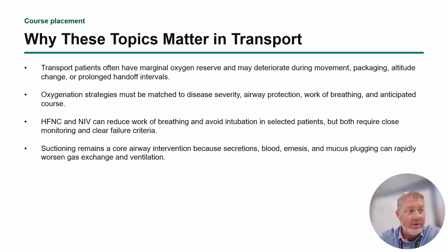Oxygenation strategies have to match the disease process that the patients have, their work of breathing, and the expected course overall that you would want the patient to have during the trip. So, high flow nasal cannula and non-invasive ventilation, those two modalities can sometimes prevent intubation, but they also fail. And then suctioning, we'll get into a little bit. That's still a core skill that everybody needs to know, and that alone can make or break any oxygenation strategy.